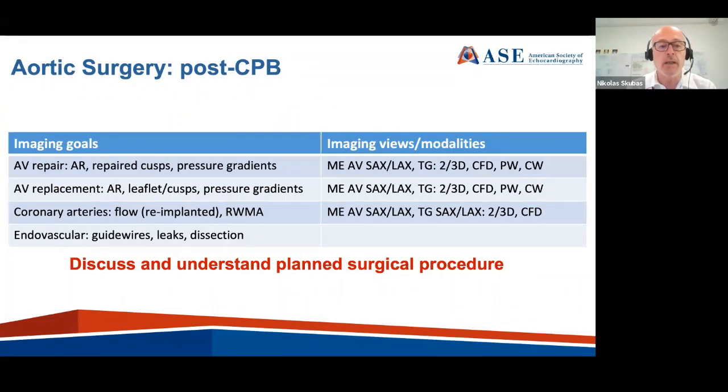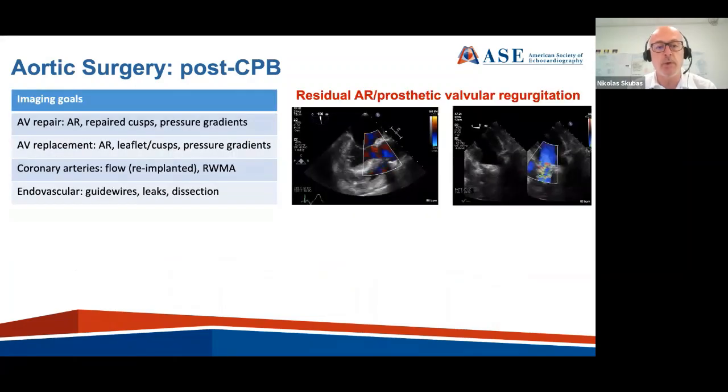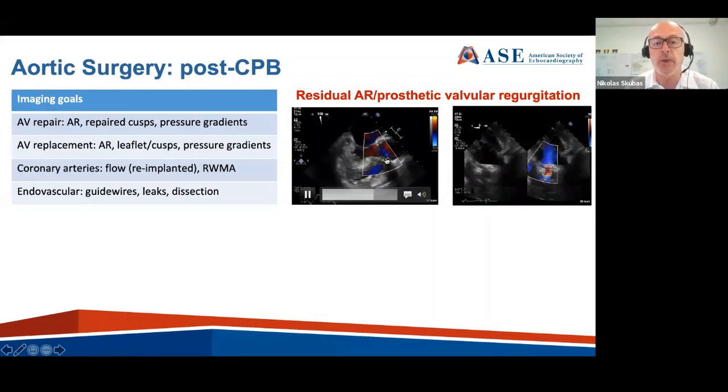So following that, with this in the back of the mind, since the plan can always be adjusted, it is worth thinking both in cases of potential aortic valve repair as well as in cases of aortic valve replacement. Either way, it is very important to quickly evaluate the presence of aortic insufficiency, whether it is due to inadequate aortic valve repair. In the first clip here, probably the aortic valve repair looks pretty good because there is not a lot of AI.